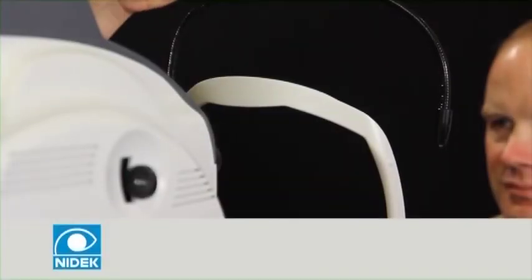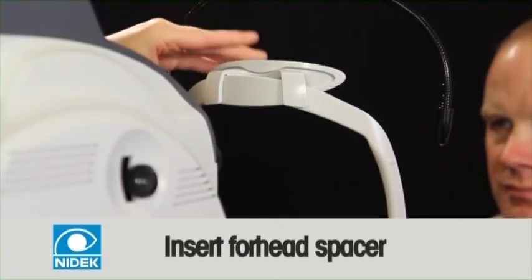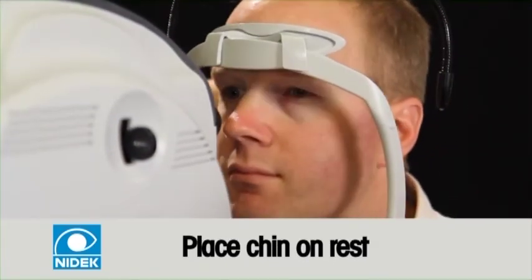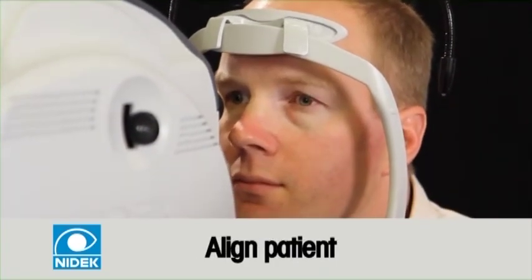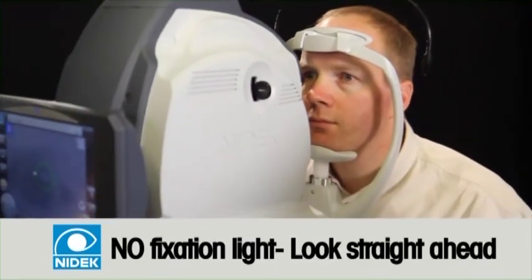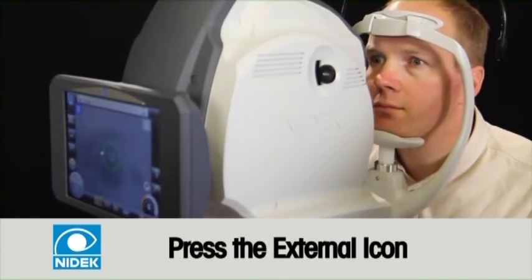To capture external images of the eye, first place the forehead spacer on the headrest for extra workroom. Have the patient place their chin on the rest and press their forehead gently on the spacer. Inform the patient that their fixation target is not in view and to look straight ahead. Press the external icon on the touchscreen.